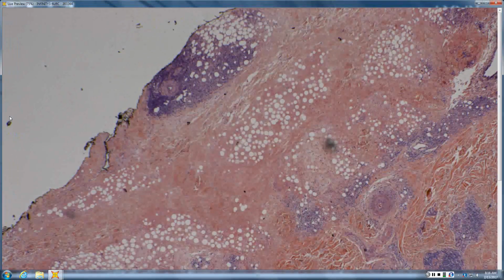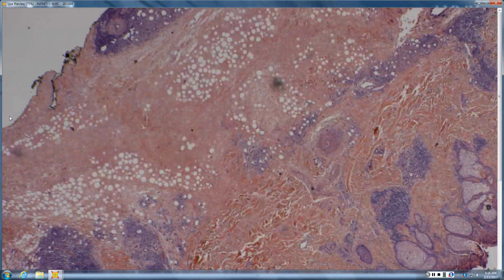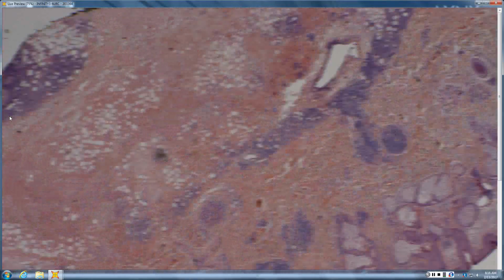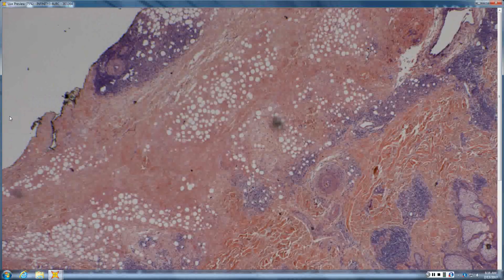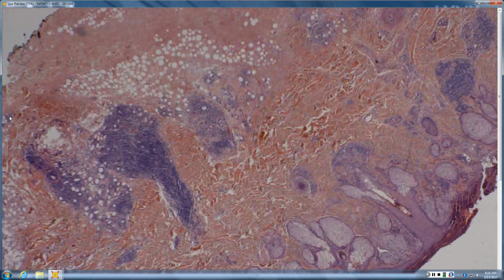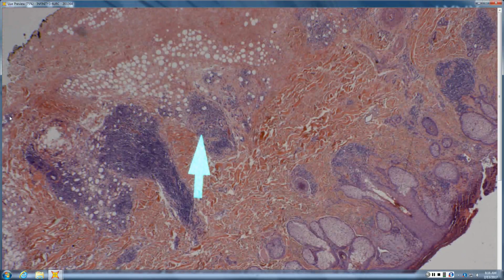So we are on facial skin here. There seems to be a nodular infiltrate, mostly in the deeper dermis, also around hair follicles, with some serum crusting and erosion at the top. And it's in the eccrine coil. So that's concerning for connective tissue disease: lupus, lymphoma, lichen striatus. Here you've got a patchy lymphoid infiltrate on the face, so you're worried about connective tissue disease.